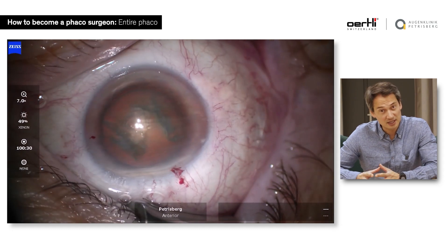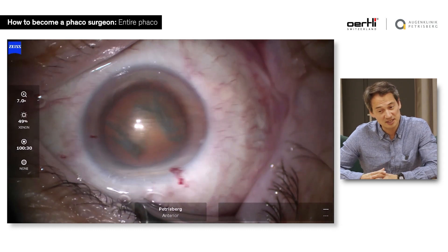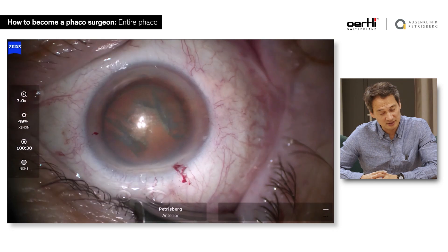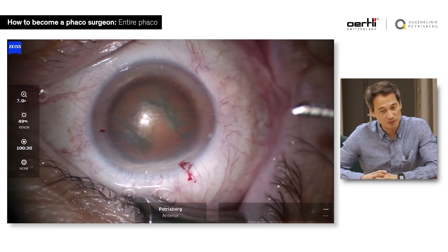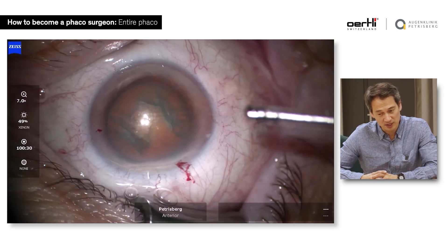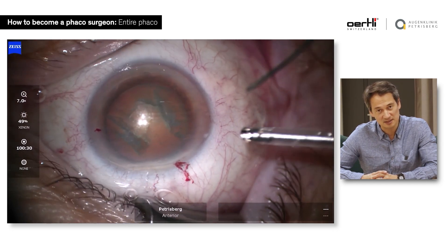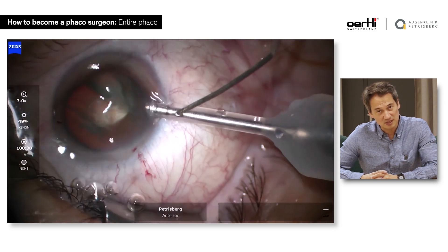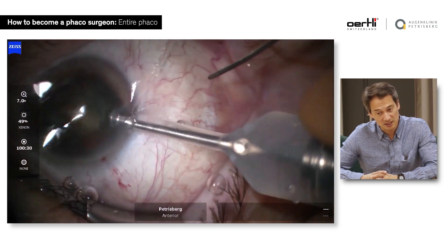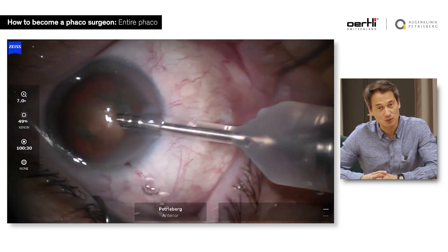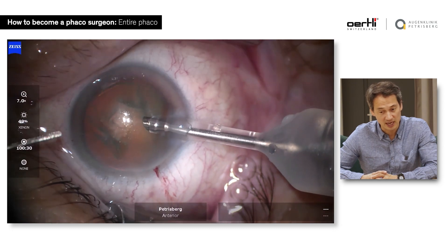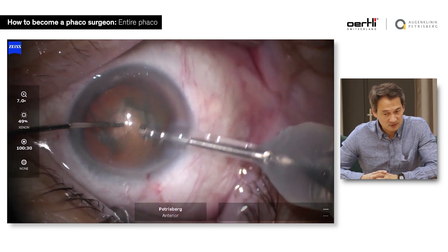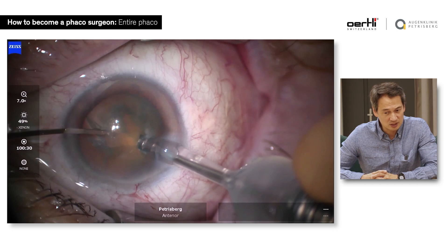Hydrodissection and hydrodelineation are very important. The FACO operation is one operation — if you miss the basic steps and try to take a shortcut, it will come back to haunt you. Just don't do it; try not to take shortcuts.